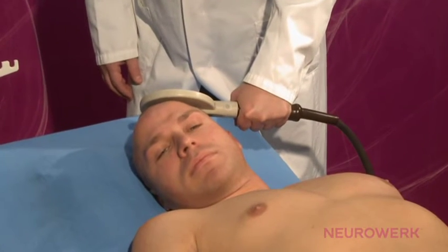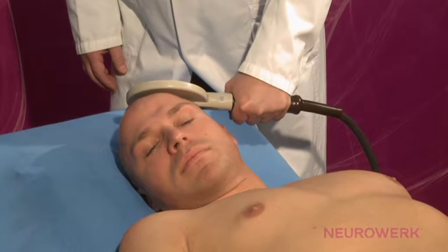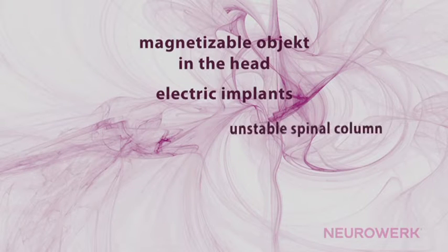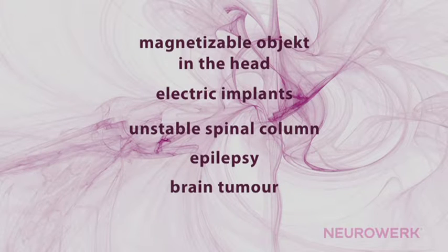Unlike the other evoked potentials or the neurography, we need to pay attention to contraindications at the MEPs. Therefore, it is not permissible to carry out an MEP examination if the patient has magnetizable objects in the head, has electric implants, has an unstable spinal column, has epilepsy, has a brain tumor, or is pregnant.